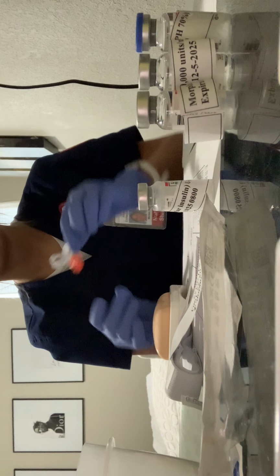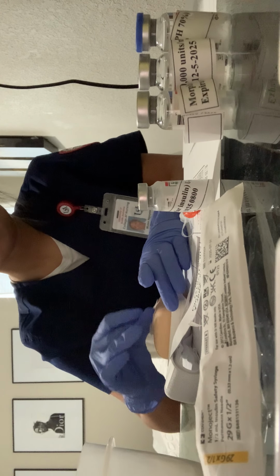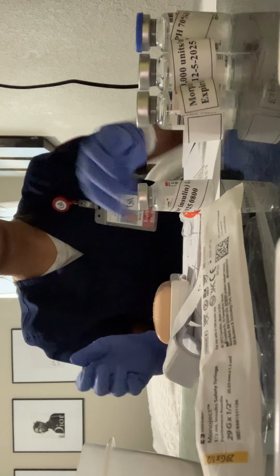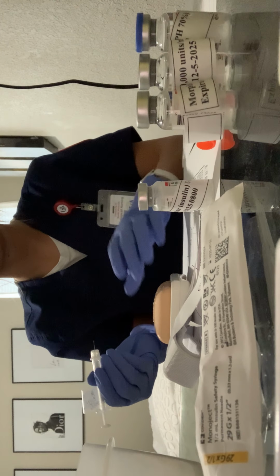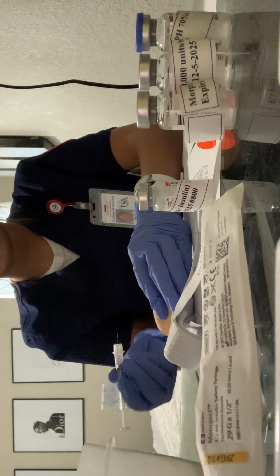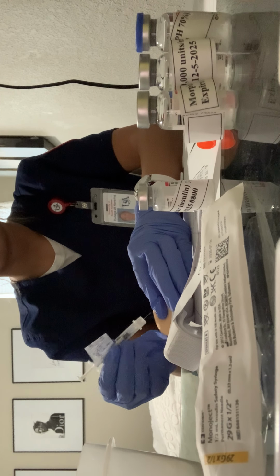So now I'm going to disinfect, circular motions moving outwards. All right, Mr. Jones, are you ready? I'm going to pinch 2 inches of the skin, and I'm going to be going in at a 45-degree angle.